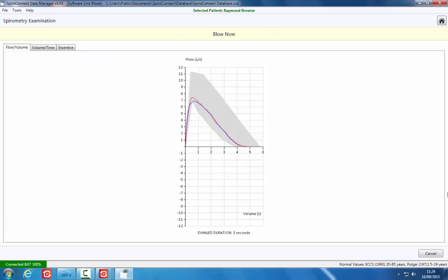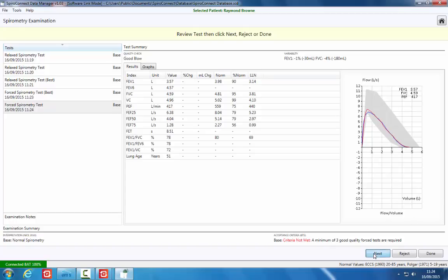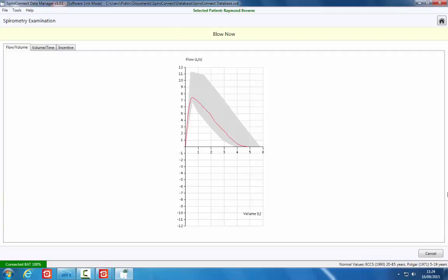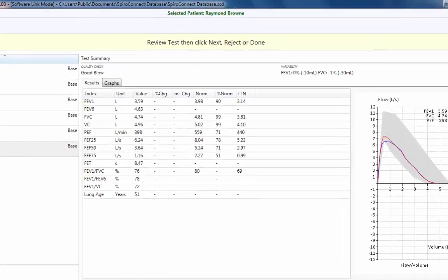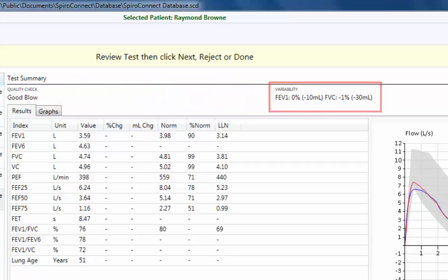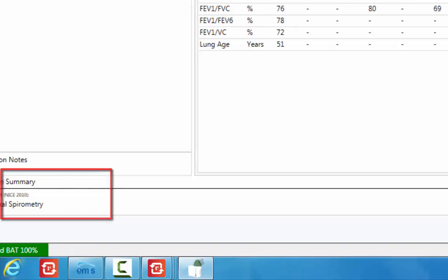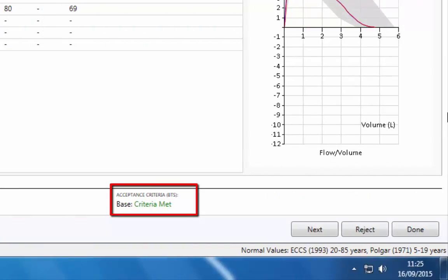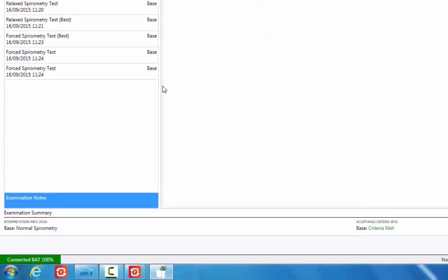A minimum of 3 blows of acceptable quality should be performed. The Test Summary displays the results after each blow, along with details of the quality of the maneuver and test variability. Test variability will be shown from the second blow onwards. The Examination Summary section shows the interpretation and whether or not the test acceptance criteria have been met, based on the guidelines chosen in the software settings. Examination notes can be added by clicking here and typing your notes in the box provided.